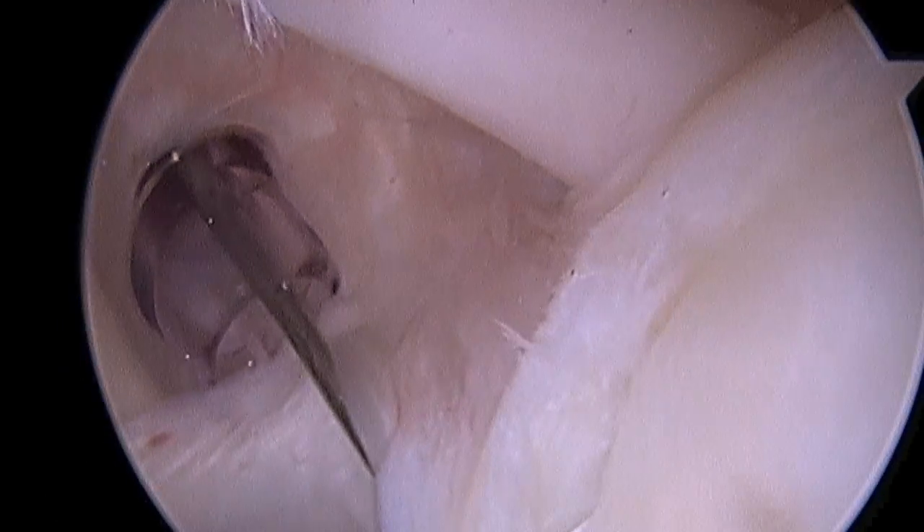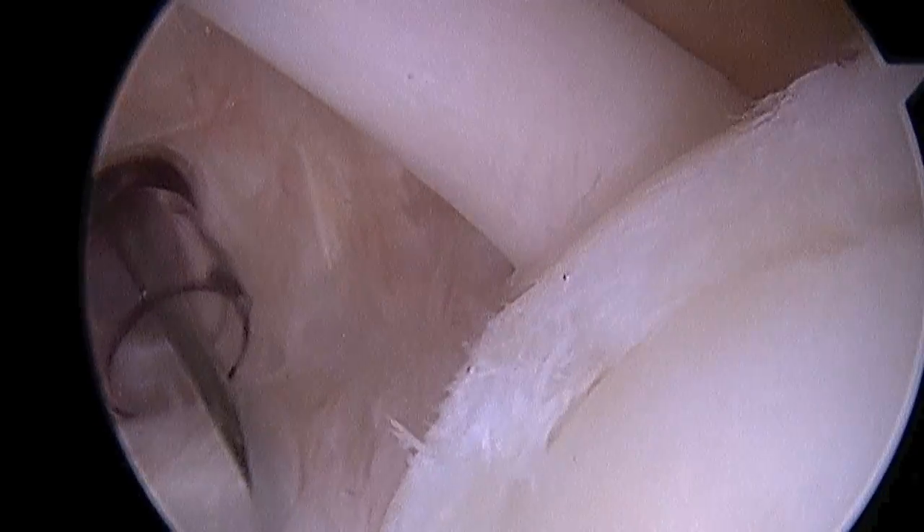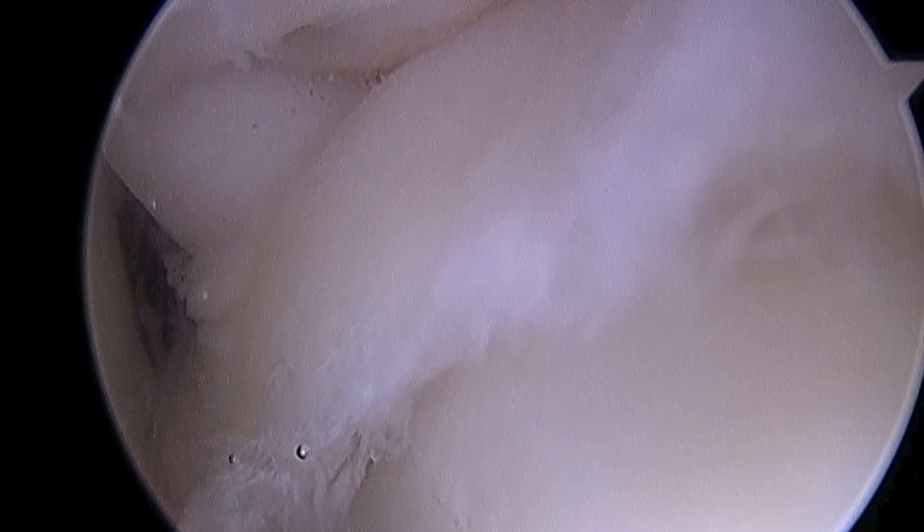Here you can see again as the biceps peels back the labrum — the labrum actually falls into the joint, and that's going to pinch between the ball of the shoulder and cause pain.